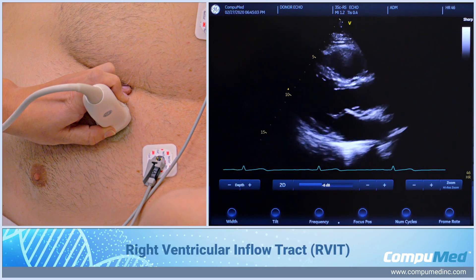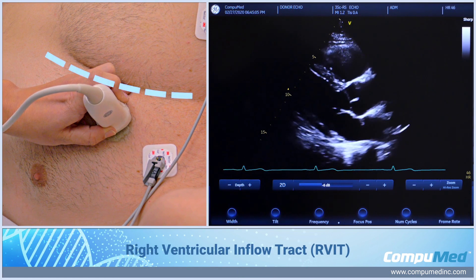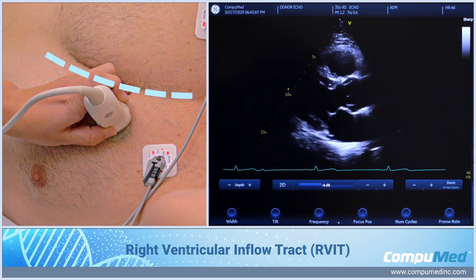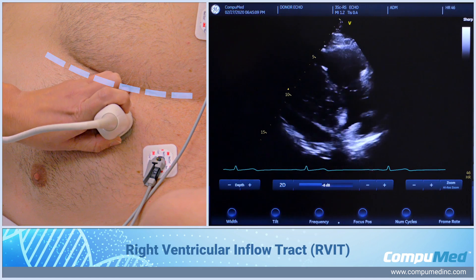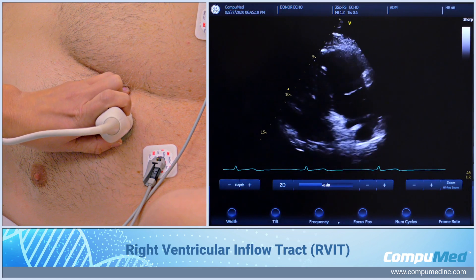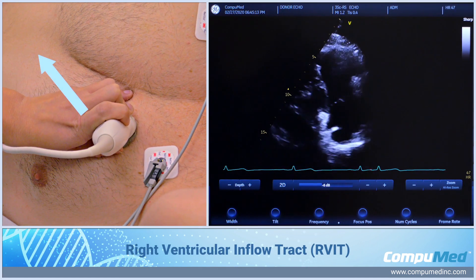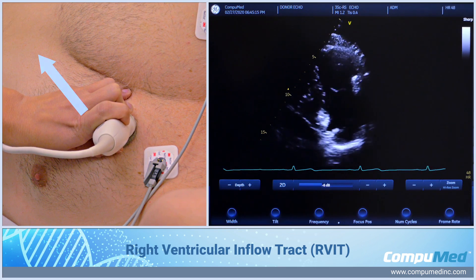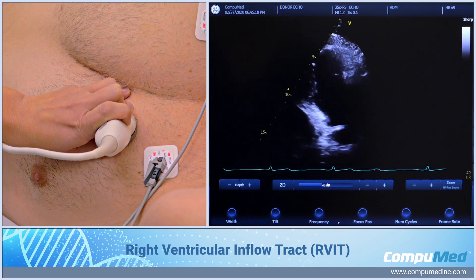From here, to get to my right ventricular inflow track, I'm just going to angle the transducer inferior and tilt up superior to bring in the right ventricle, right atrium, and the tricuspid valve.